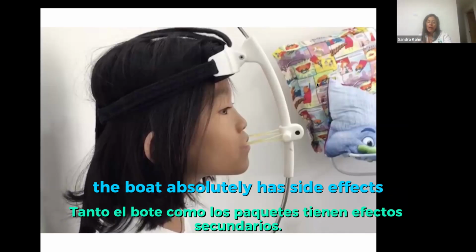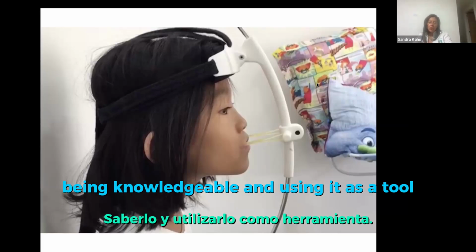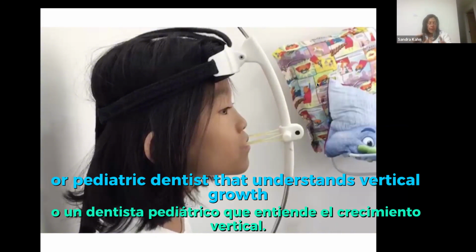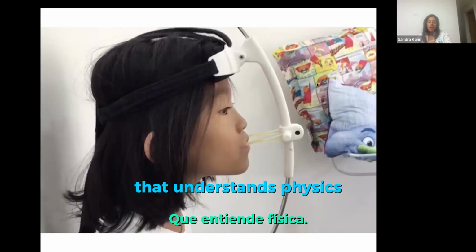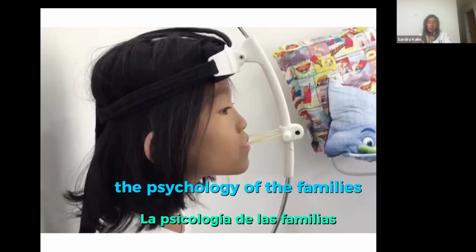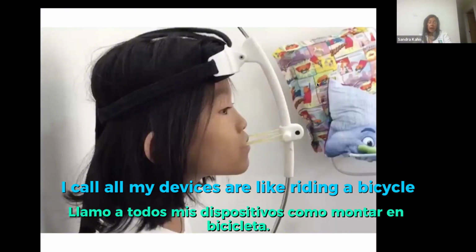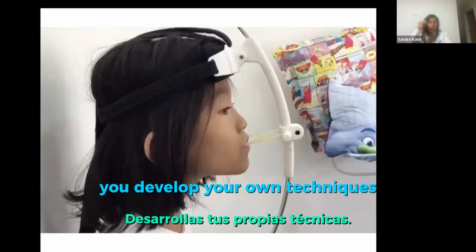The bow absolutely has side effects. So we have to use it being mindful, being knowledgeable, and using it as a tool in the toolbox of an orthodontist, orthopedist, or pediatric dentist that understands vertical growth, that understands physics, vectors of force, and understands the psychology of the families and the patients that are going to be using this. I call all my devices like riding a bicycle. You start using it, and as you use them, you develop your own techniques.